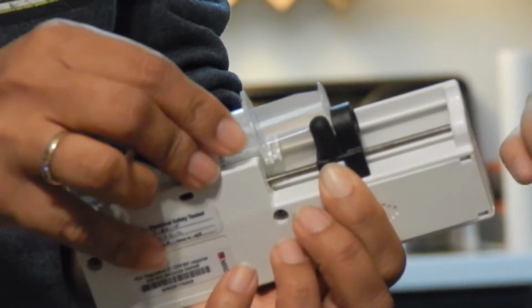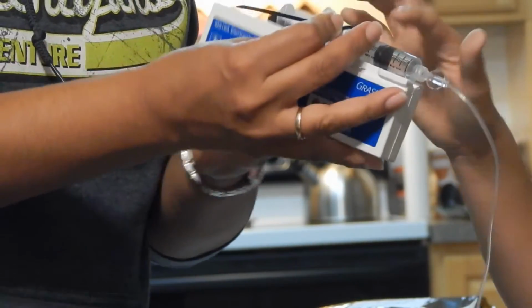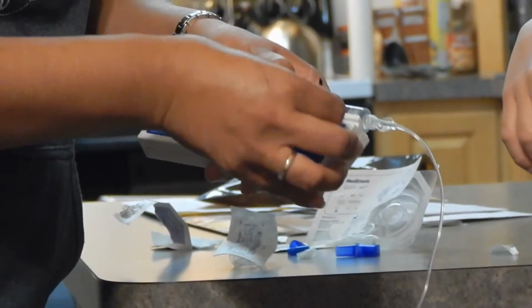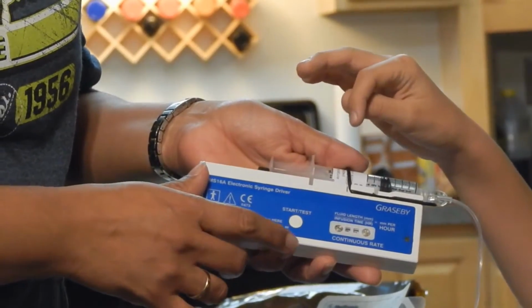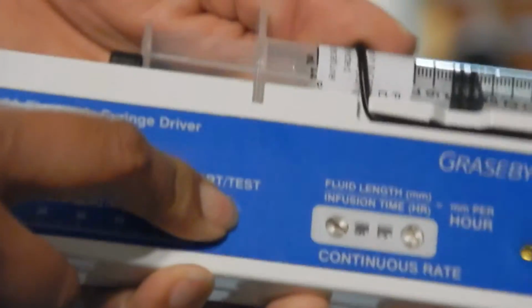And then you see this pump. You get the pump that comes with the whole thing, and then you put the syringe right there and make it so that it fits snugly and isn't forced or pushed. Then you grab that black wire and put it in the hole in the pump next to the syringe. Then there's a button that says start or test. You press it once, kind of hard, not too hard and not too soft, and then a yellow light starts flashing. That means it's on.